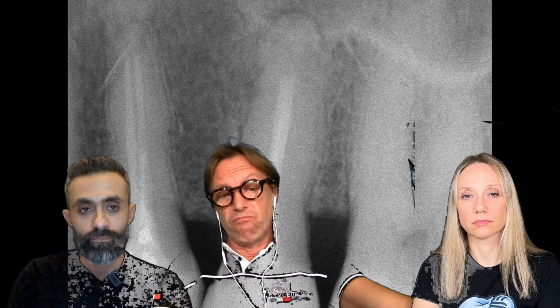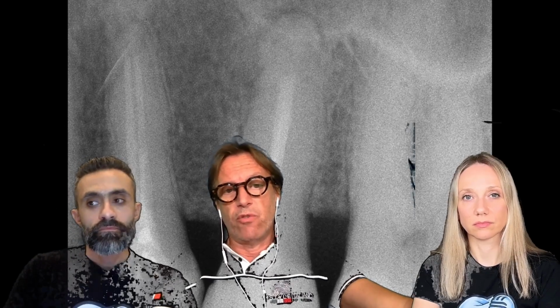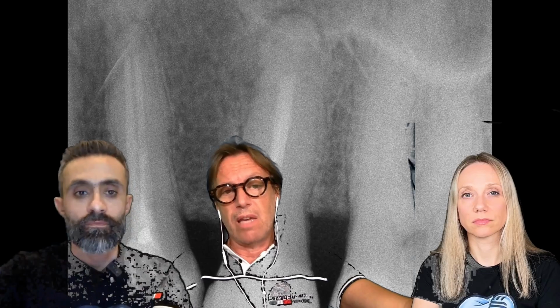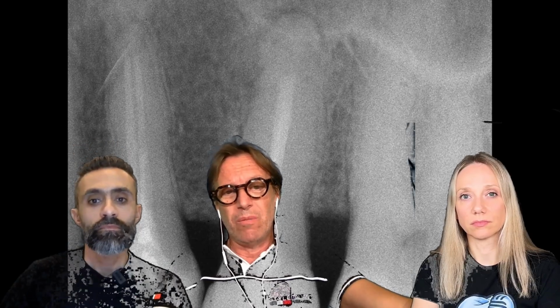It was a fully ceramic crown. So that's why we decided on the surgery. And in this case, I prefer to have a CBCT before, because the lesion is lateral. So I don't want to make a big apical resection.